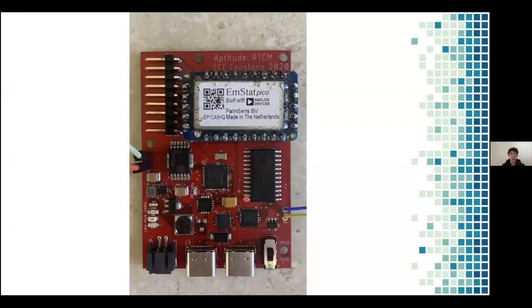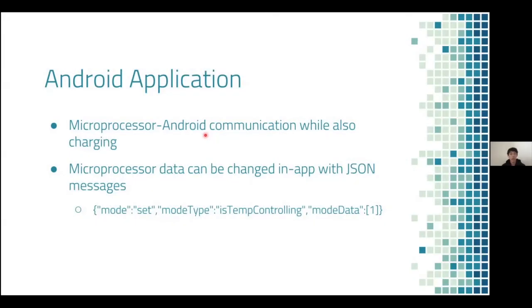Here is our finalized hardware system. And right now, we just need a software interface to control the system. And we got our Android application. The Android application can communicate with the microprocessor while charging. And the microprocessor data can be changed in app by sending a JSON message.